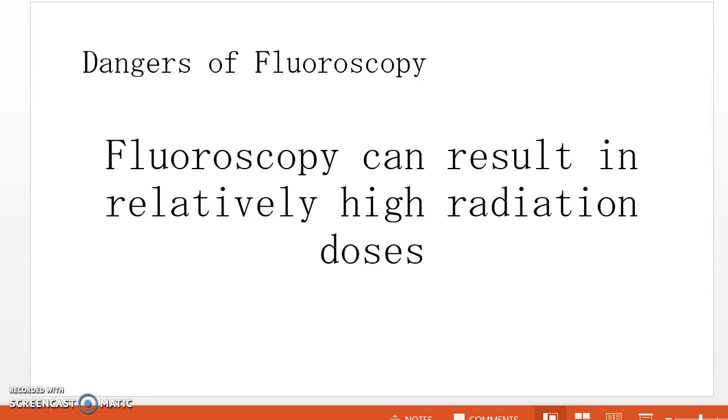As with anything, there are dangers with radiation. So with fluoroscopy being live and not just a still shot like a regular exam, you're continuously being exposed to the radiation.